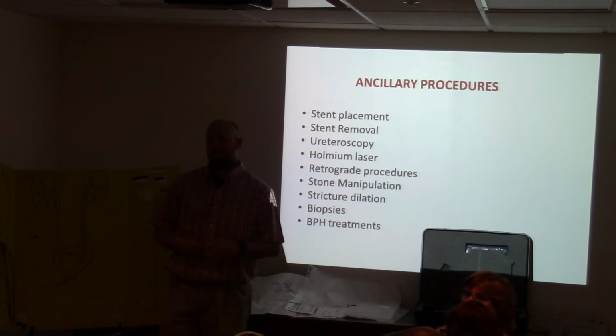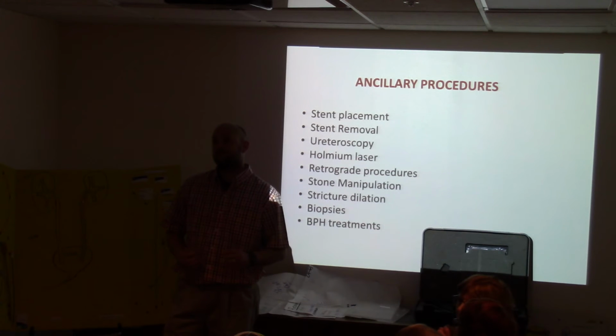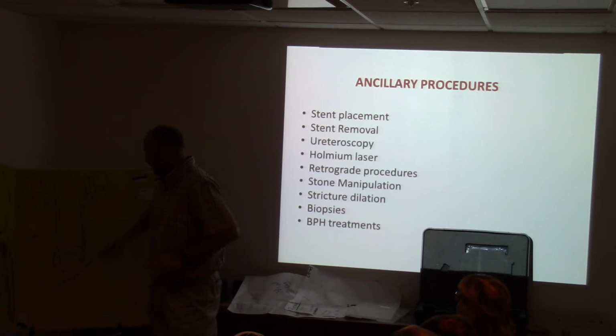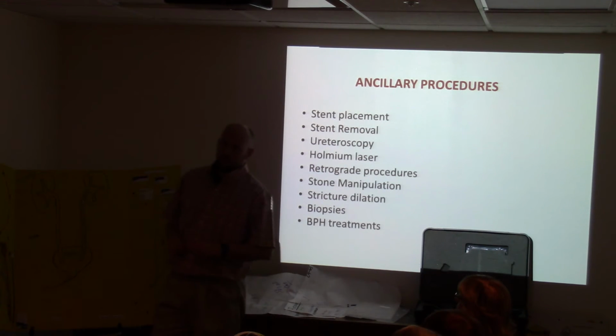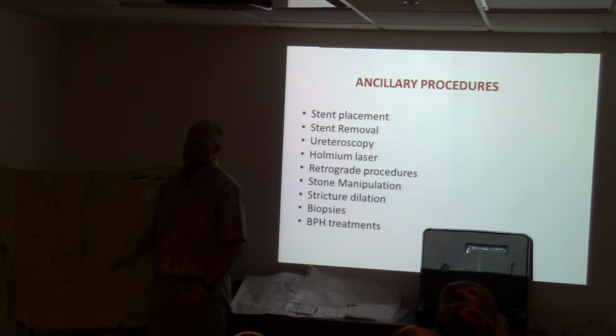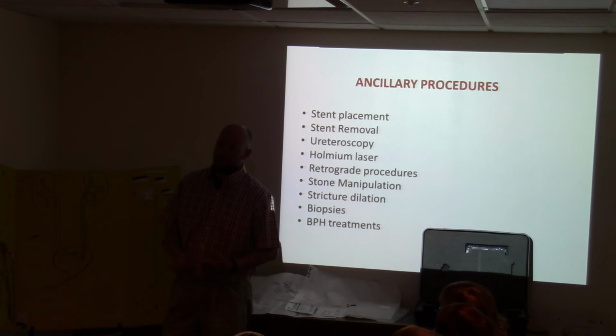Nancy, is lithotripsy still the gold standard for treating stones? It depends on the physician. It really is, and it depends on the location of the stone. So if you have a stone down here, your pelvic bones cover this whole area down here. And if a doctor wants to do a lithotripsy down here, the best thing for the patient is to do a ureteroscopy.